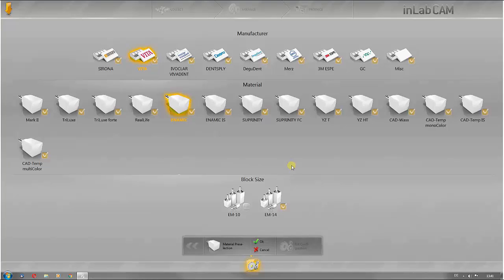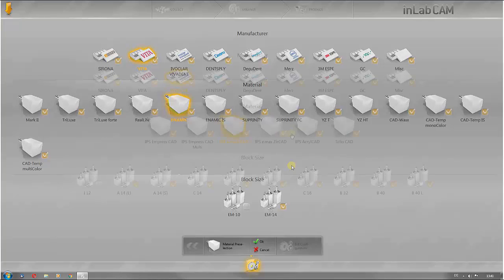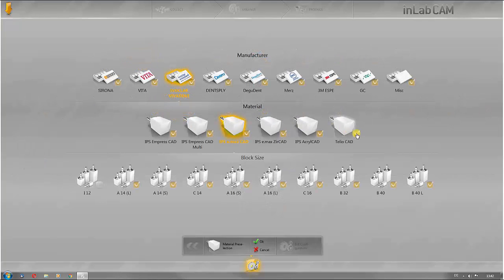You can also make such individual material selections for other manufacturers. Of course, entire material groups and manufacturers can also be hidden.